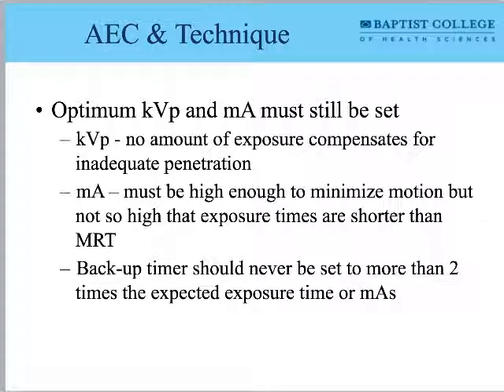The one that was appropriately exposed is going to look exactly like the one that was fried 500 times over. I'm not joking, because I've actually done experiments even in this old system here with the Fuji where I did just hand x-rays. I did hand x-ray on the film system, and then I did hand x-ray on the digital, because we used to have film. A dose that would have irradiated the patient 500 times over. We could have gotten 500 hand x-rays. If we did that on the digital system, you still got a pretty picture.